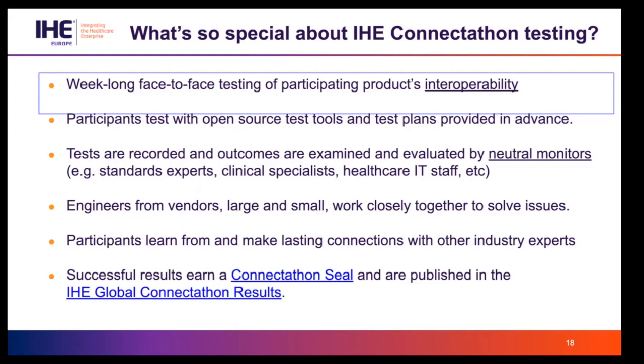Yes, we have test tools that test the compliance of your messages or your DICOM images or your documents, but the real focus is on use case testing. The tests are documented, the steps are specified and required, and the peer-to-peer testing happens between the engineers.